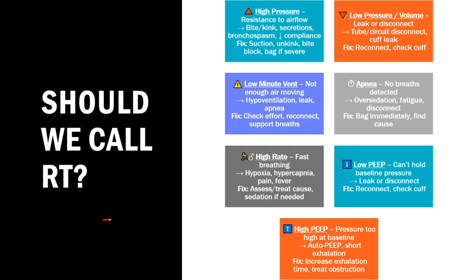if this is the waveform on the ventilator, okay? So we breathe in, we breathe out, right there. PEEP would be the amount of pressure right here. I can't draw on this keyboard. But PEEP would be what's left inside the lungs whenever we're done breathing. Try this again. So breathe in and breathe out. This baseline line right here is your PEEP.